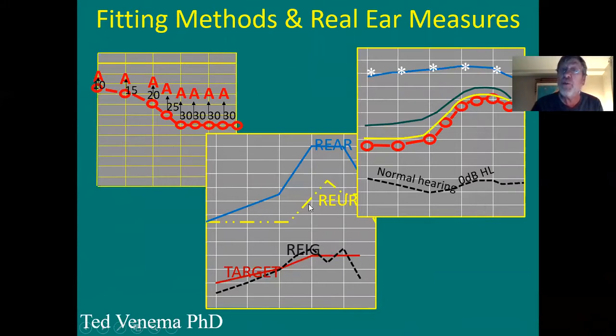They put the tube in the ear canal and they measured the resonance of your open ear canal. Then they carefully held that tube in place, took the hearing aid, put it into the ear on top of that tube and measured what's going on then. So the difference between aided and unaided ear canal response was your insertion gain.